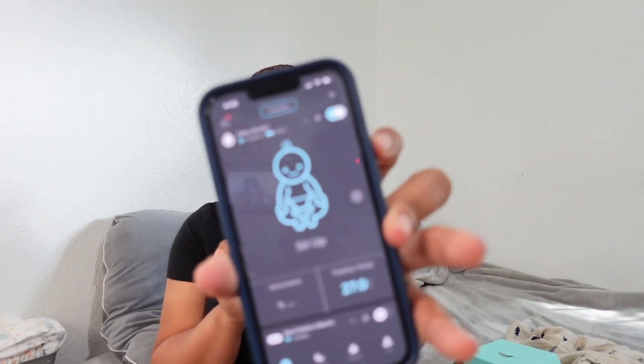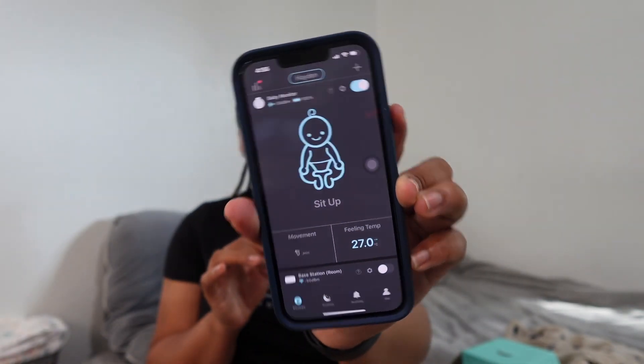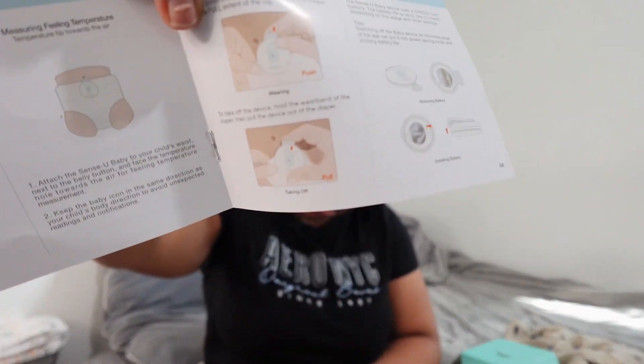It's just showing me everything I need to see. This is how it looks — the app interface shows everything, including my baby's name. So let me connect this to my baby while he's sleeping before he wakes up. It's showing me how to wear and take it off. I'm going to connect the camera to the wall when I'm ready.